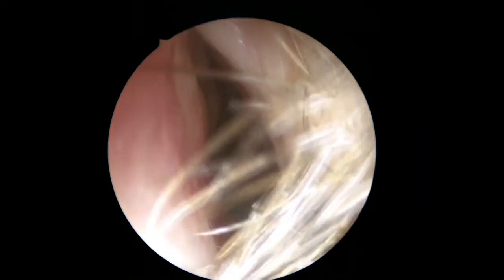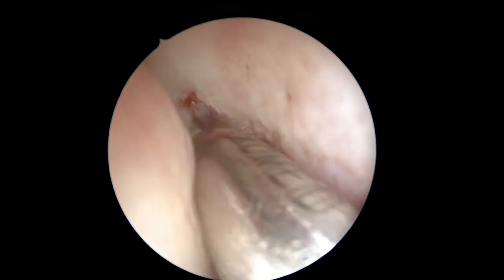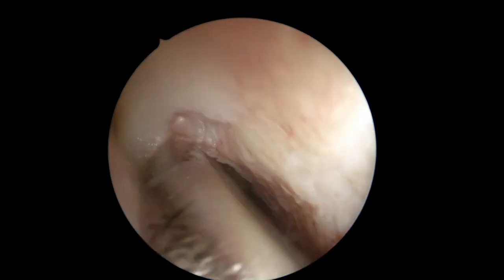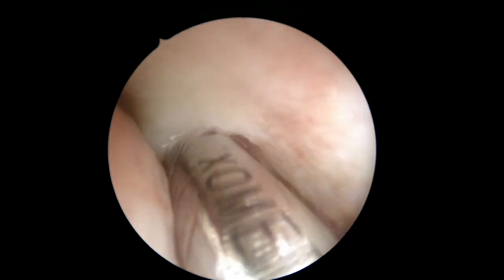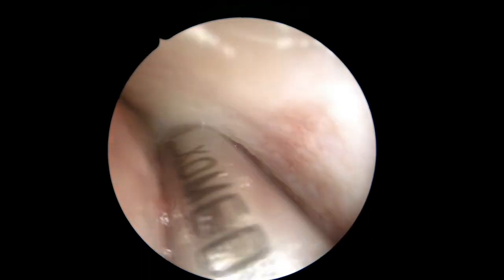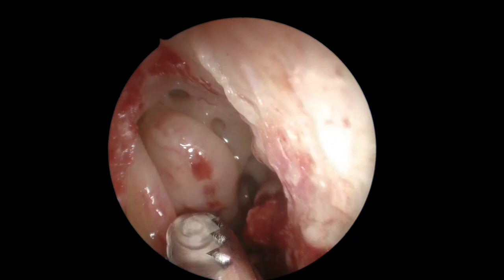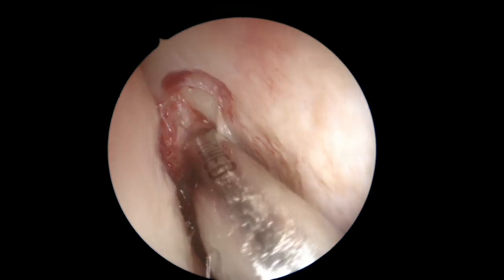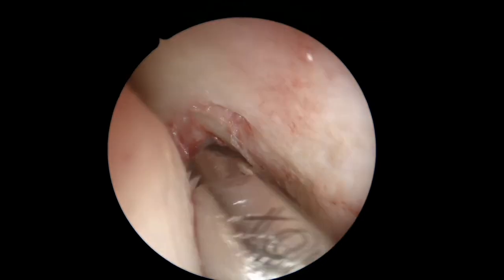After removing the uncinate process, we're using the debrider a lot — just to remove the redundant and inflamed mucosa. You can see here that it's almost a polypoid type of mucosa that we have to remove in order to see the bone. Remember that sinus surgery is not about treating the mucosal inflammation, but about removing bone to expose and open the sinus cavity.